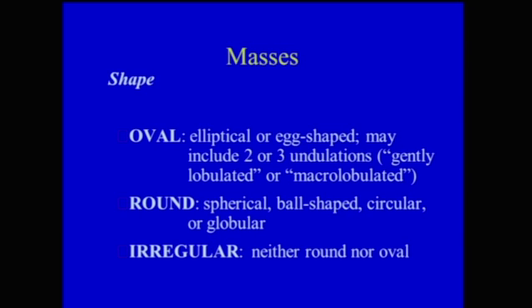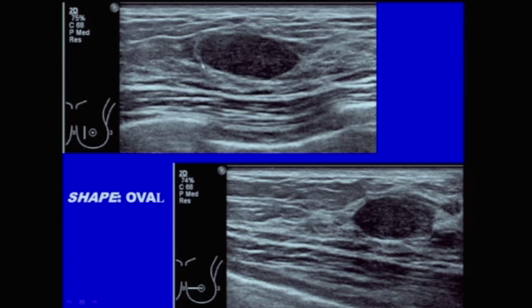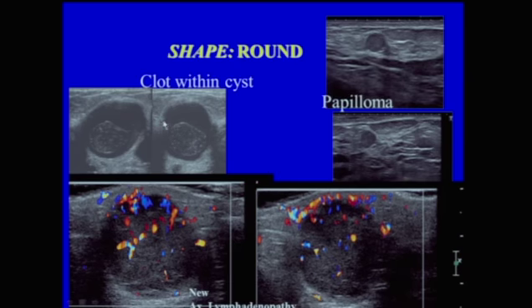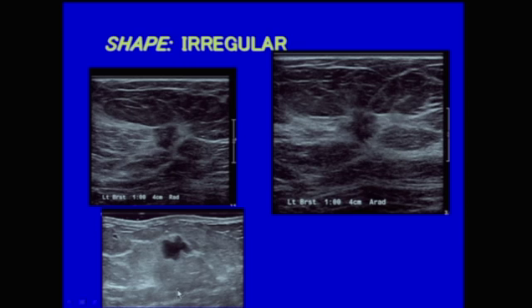Here's an example of an oval mass in two projections. Three different cases of round masses are shown, where in both projections the masses are round: one is a papilloma, one is a clot within a cyst, and one is a new metastatic lymphadenopathy. Irregular is when the mass is neither round nor oval — three different examples of irregular masses are shown.